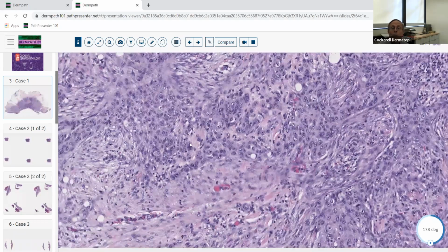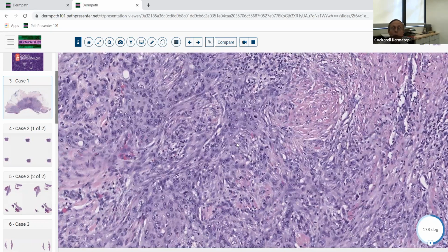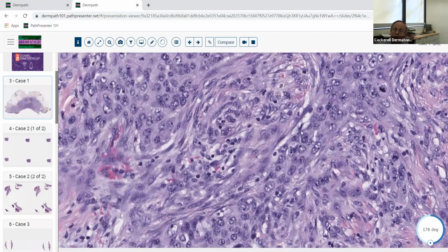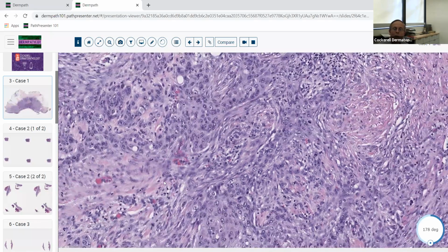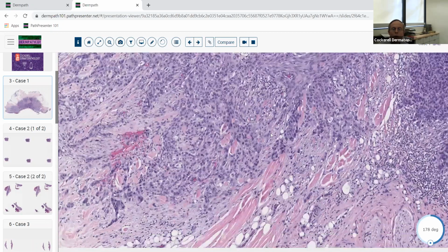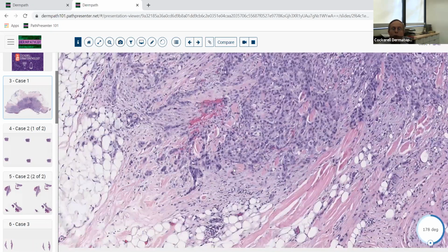The other thing you want to look for when you're dealing with squamous cell carcinoma, especially more so than basal cell carcinoma, is whether there's a possibility of neurotropic spread. I don't see that definitively here, but you can see these little aggregations of squamous neoplastic cells. There's a mitotic figure here, so it's obviously malignant. It's kind of whirling in a way around. There might be something in the background here. So when you see that pattern, you always want to look to see if there's any possibility of neurotropic spread.